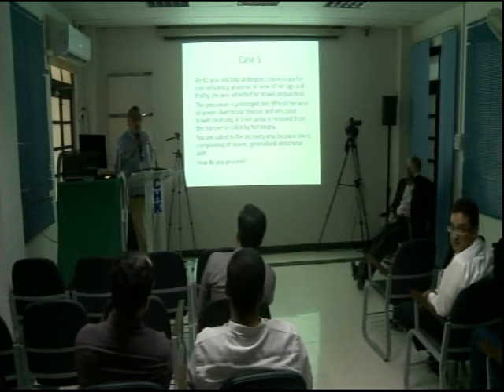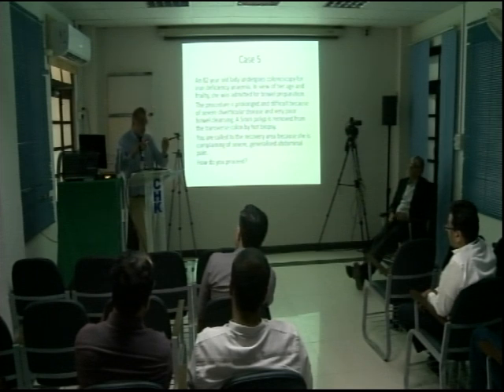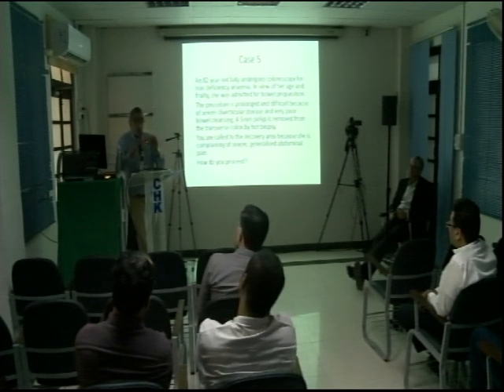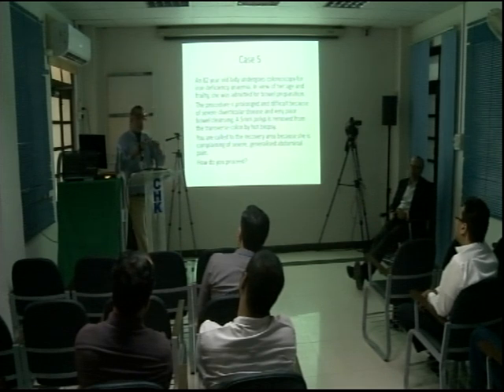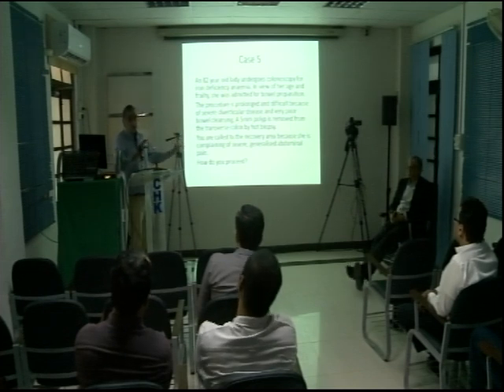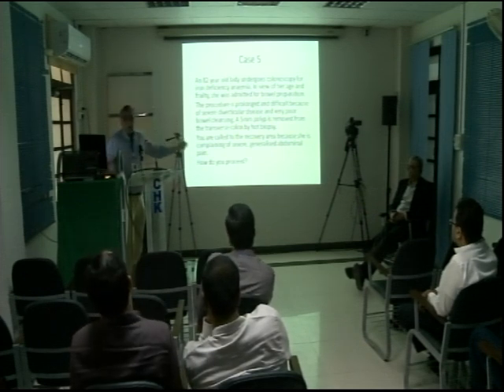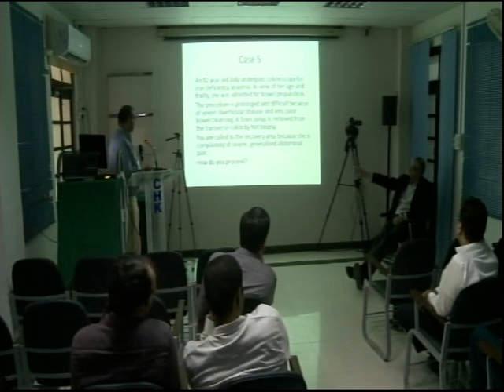The problem with hot biopsy forceps is that when you grasp the polyp and press the pedal, people keep pressing it down till the whole thing becomes brown. That shouldn't happen. When you see it blanching, when it turns white, that is when you should take the biopsy off, because turning white means you have cut off the blood supply. It shouldn't be used at all. In our hospital it isn't used. So these 2-3 things are worth noting. Let's go on with this.